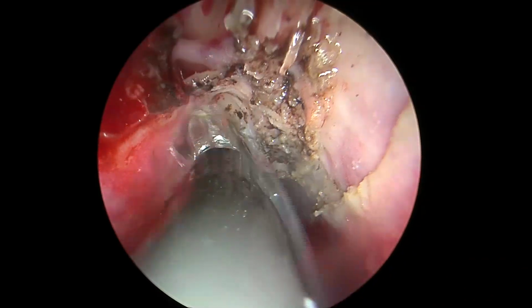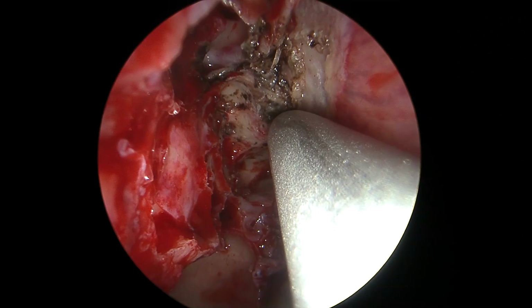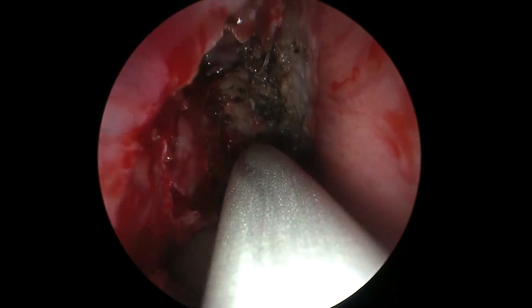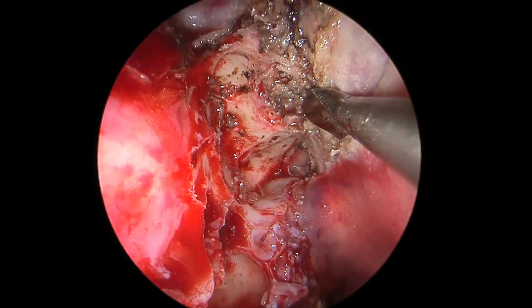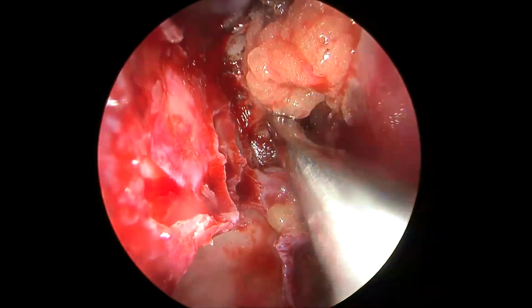A little bit of meticulousness and over denudation of the mucosa around the angles and the superior aspect of lamina papyracea can come in handy. This is where we use our navigation probes to once again map and double and triple check that we are right on the skull base defect as seen on our CT scans and MRI scans on the navigator maps. And once we have done that, our field is now very much set to be grafted.